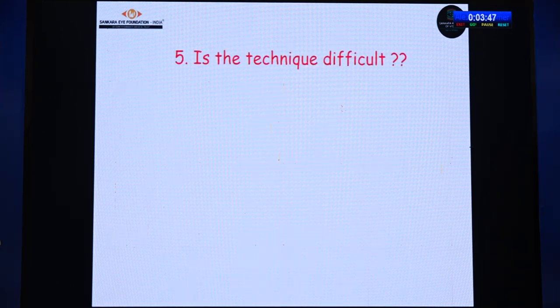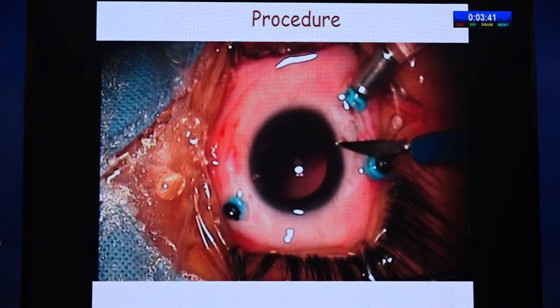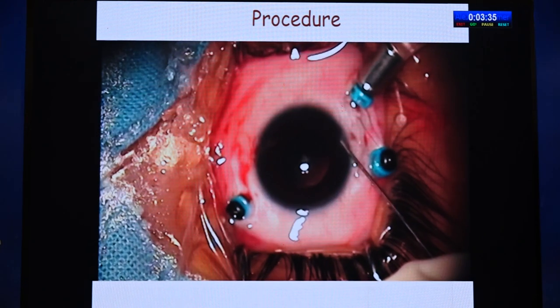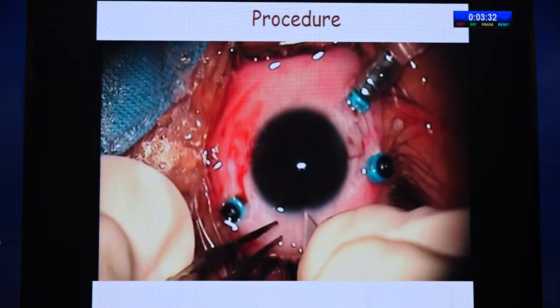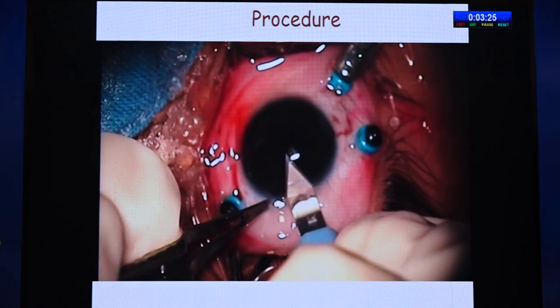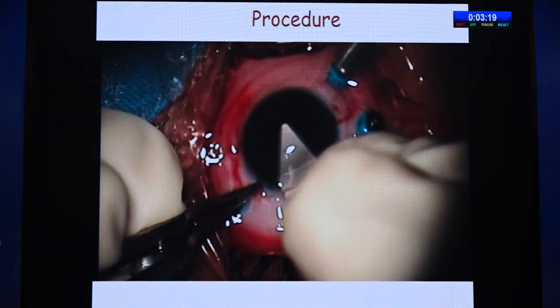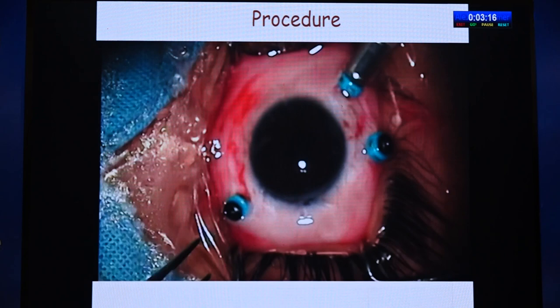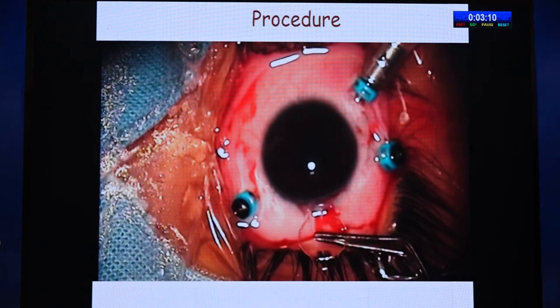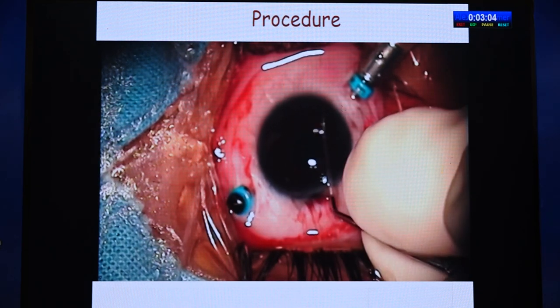Is the technique difficult? Absolutely not. It is a very simple technique with a minimal learning curve. I do it mostly as a secondary procedure, or sometimes as a combined procedure with a colleague. My first step is always a side port — especially in a vitrectomized eye, it's better to do the side ports first. The incision can be either temporal or superior, and either corneal or scleral. I always prefer a superior corneal incision to save the conjunctiva for any future trabeculectomy, and also because in a scleral section the AC may collapse — corneal incision gives better AC stability.